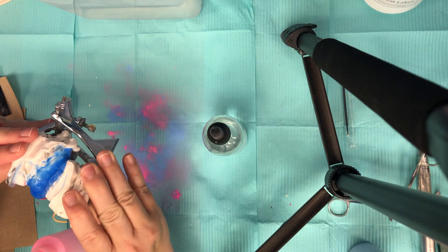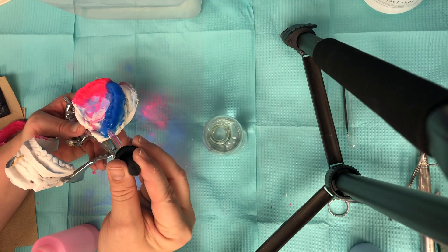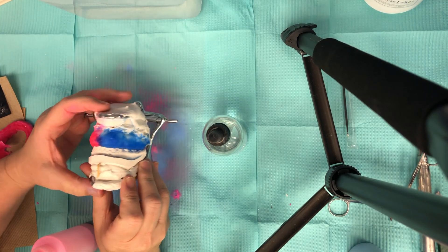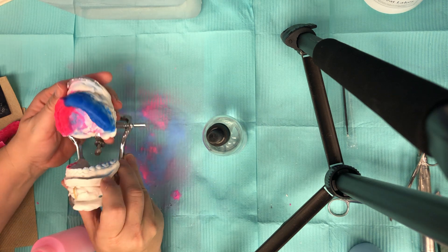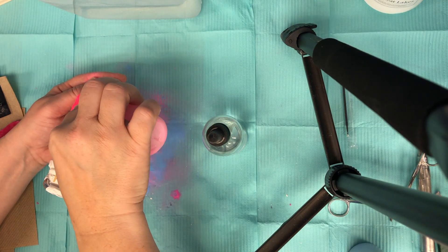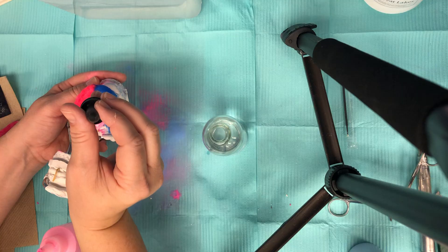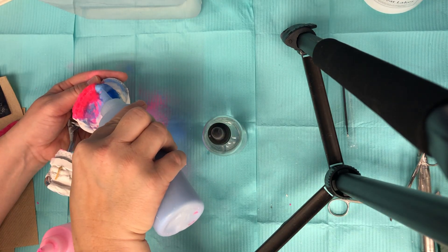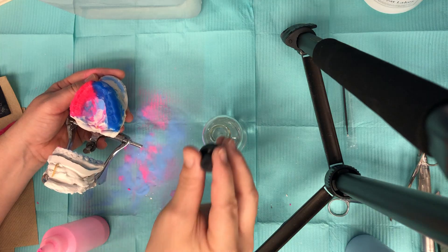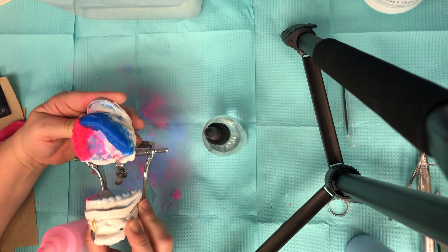Let's go ahead and check our bite. It's really good in the back. I'm going to wet this a little bit. I especially want to check the anterior where the color changes from pink to blue to make sure I'm not making that too thin just for the sake of making a cool splint with two different colors. I think we got that.